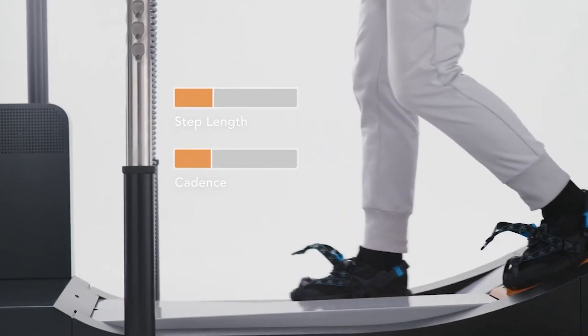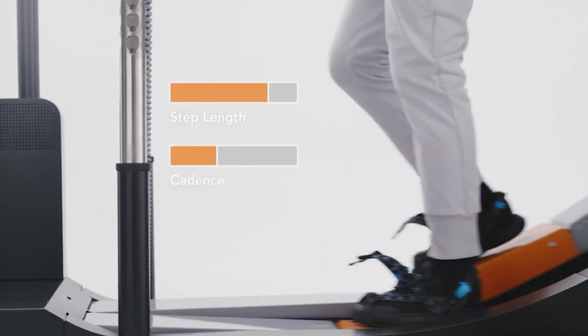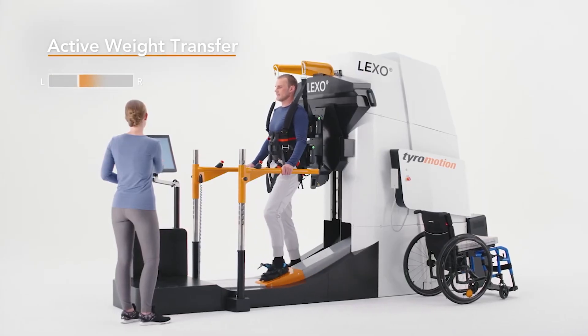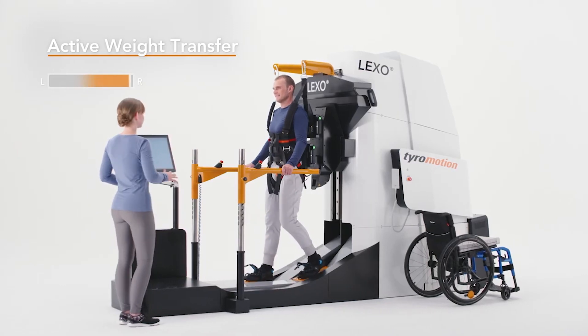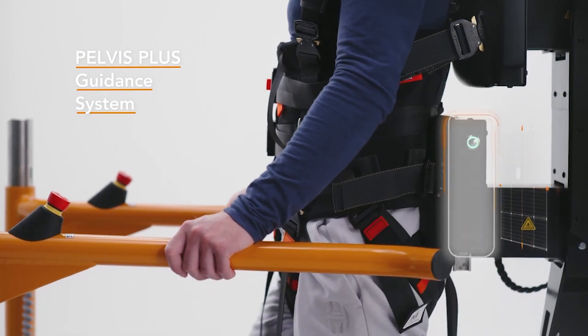During therapy, step length and cadence can be set to optimize rehabilitation without interruption, which further increases net therapy time. Immediate biofeedback monitors the patient's own activity during different phases of walking and active weight transfer, which contributes to the continuous improvement of the main goals in gait therapy.